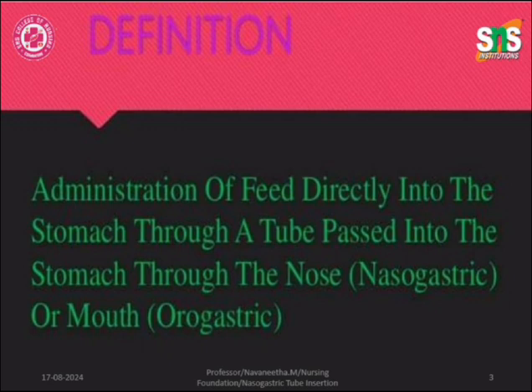Patients in the hospital as well as home care settings often require nutritional supplementation with enteral feeding. The enteral feeding can be administered via nasogastric, nasoduodenal and nasojejunal means. The focus of this clinical practice guidance is on the nursing management of nasogastric tube feeding. Nasogastric tube feeding may be accompanied by complications, so it is important for the practitioner to be aware of how to prevent them.